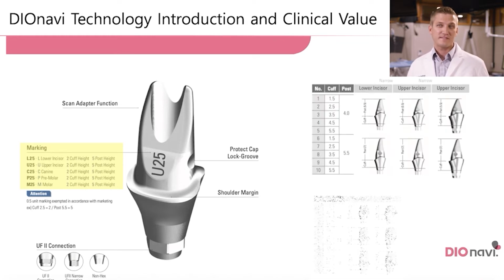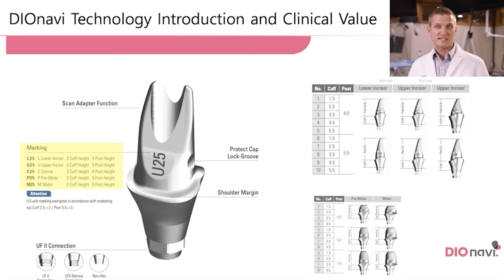They come in a variety of sizes, as I mentioned. You're seeing some of the size options right there based on anatomy, based on size and shape of the surrounding teeth and tissues. You'd select the right one from that. It's all done in the digital world, though, for you. So in the digital world, they can measure, look at that, hand select the right one for you.